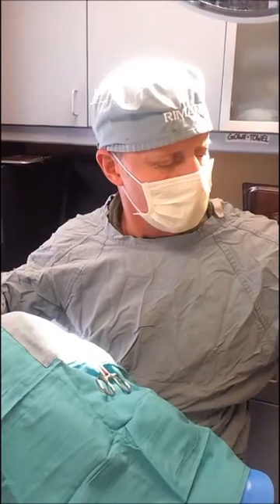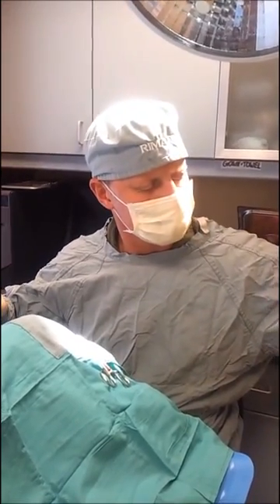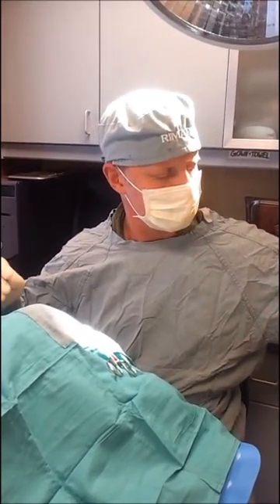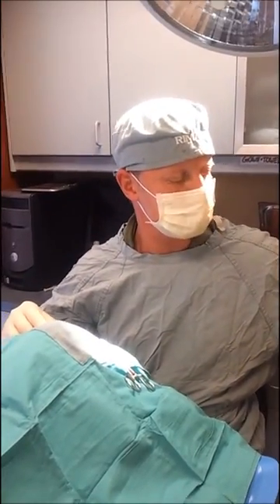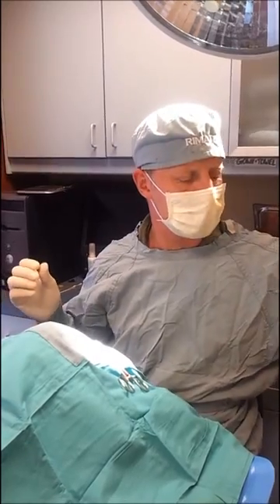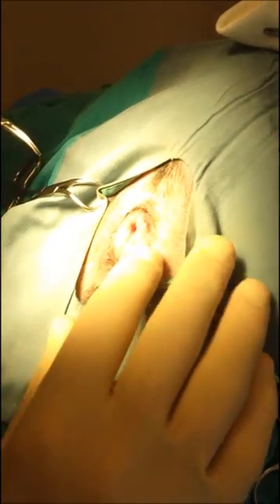Instead of doing the en bloc excision of anal glands, which is the standard way of doing it in dogs and cats, in the exotic world for ferrets, we learned 20 years ago how to do anal gland sacculectomies by just doing a circumferential excision of the duct and taking the gland out through the duct incision, which ends up cosmetically much more exceptional than doing a large incision on the body of the gland.